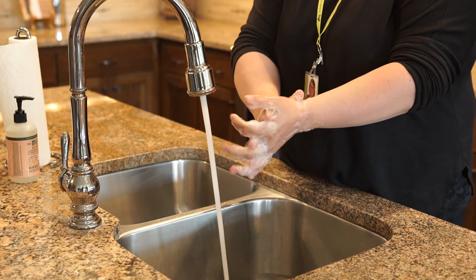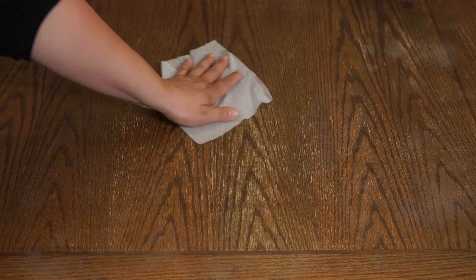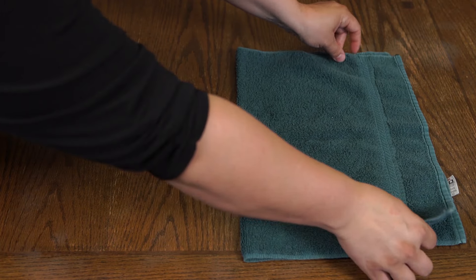Clean your hands with soap and water or alcohol-based hand sanitizer. Clean your work surface with soap and water or a disinfecting wipe. Cover your work surface with a clean cloth or towel.